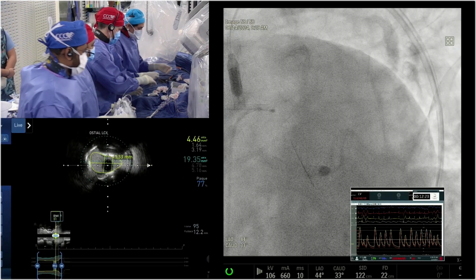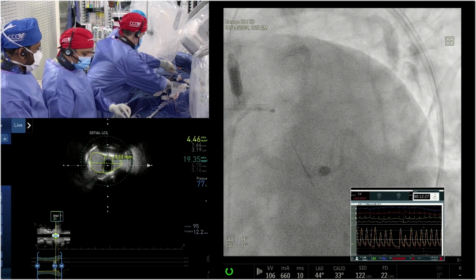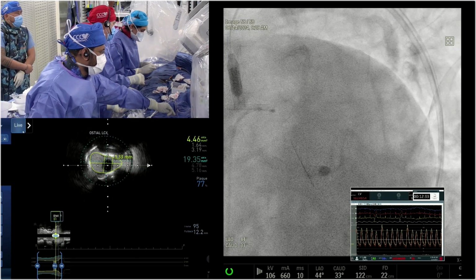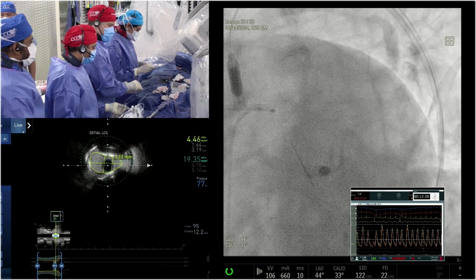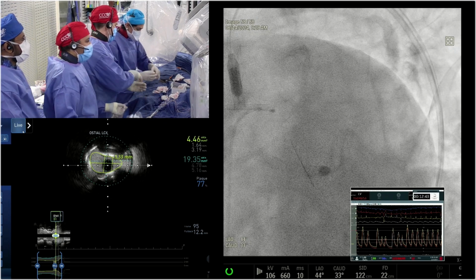Sizing is critical in these nodules. There are two things in IVL. Number one is sizing, and number two is balloon prep. The bigger the balloon, the harder its prep. And if it has bubbles, it doesn't work in nodules. You really have to be very methodical in prepping this balloon. So balloon prep and sizing is crucial in large vessels.